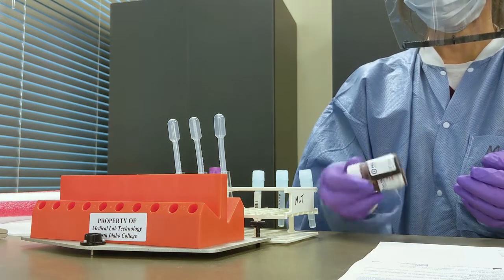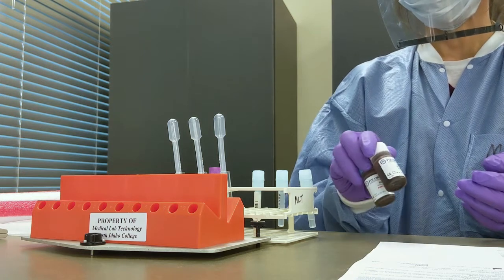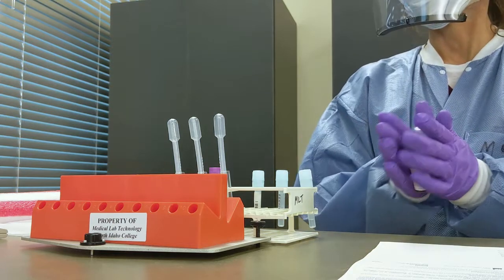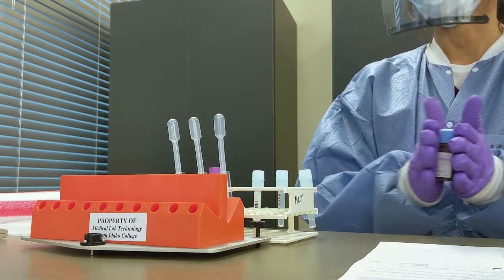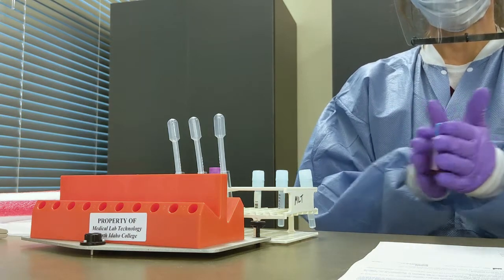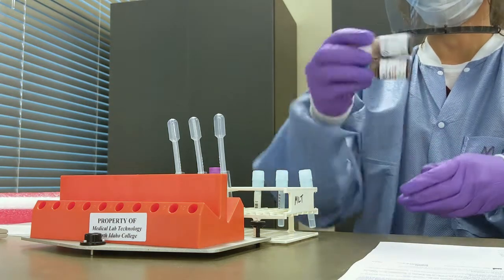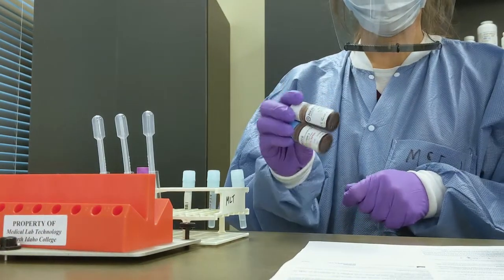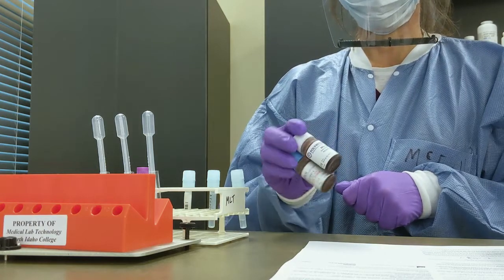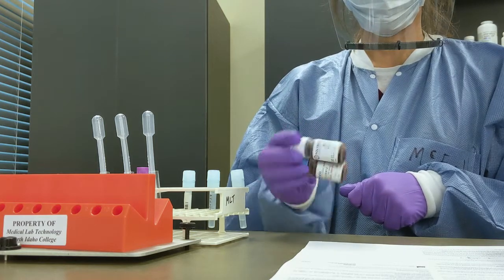Quality control has to be done with every test. For these particular controls, as with any control, you have to follow the manufacturer's insert. You need to vortex them, then roll them through the palms of your hand, just like the insert tells you. Everything must be done according to your standard operating procedure.